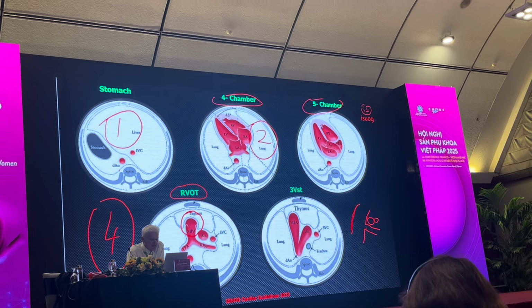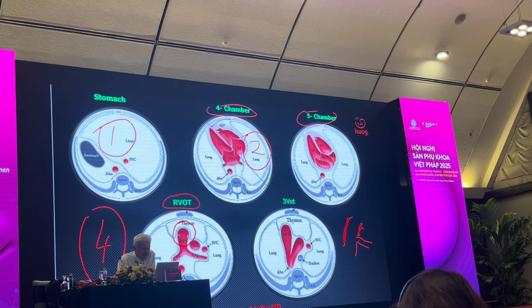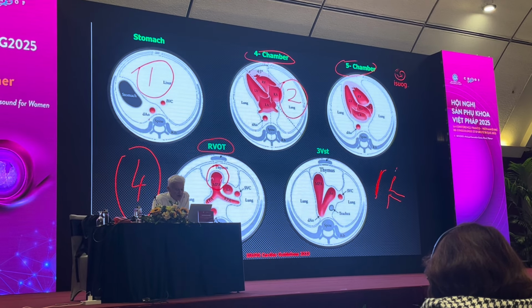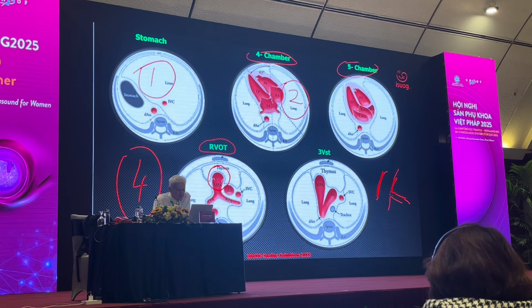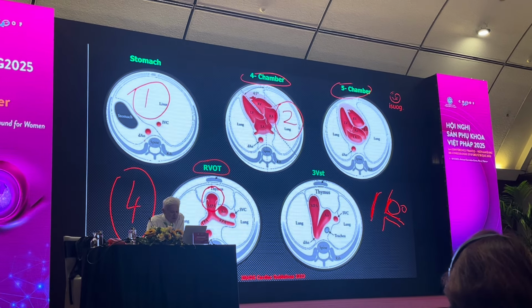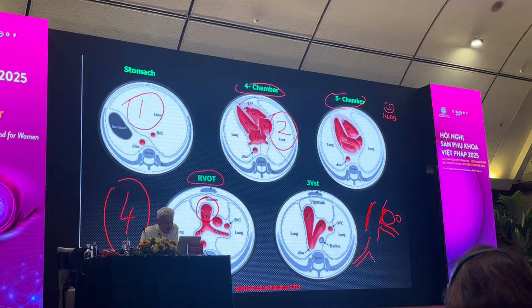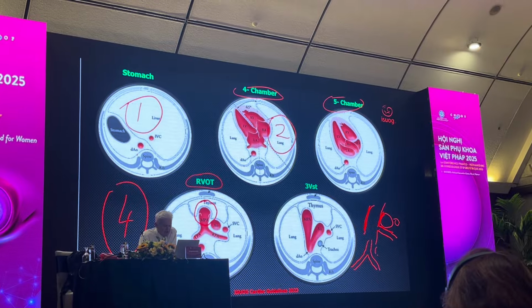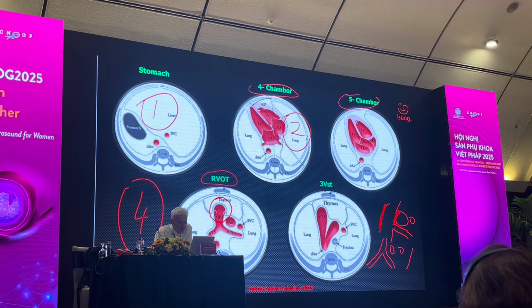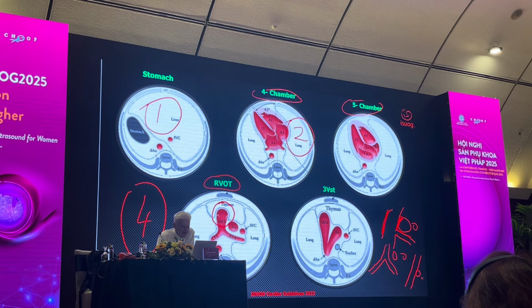So one, you need to have the right ventricular wall in view to see the pulmonary valve. Two, you need to see that the pulmonary artery is bigger than the aorta and is bigger than the SVC. Number three, when you look at the pulmonary artery, you look at the branch of the pulmonary artery that goes behind the aorta. You may also see the pulmonary artery dividing into the left main branch and the right main branch, with the aorta and the SVC. Or you may see the pulmonary artery continuing straight as the ductus arteriosus with the aorta and the SVC.